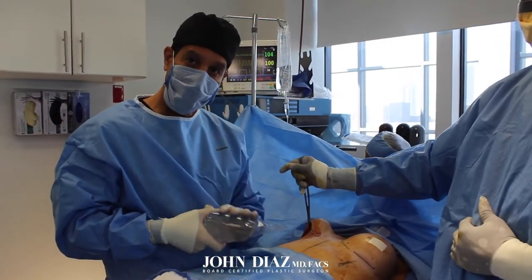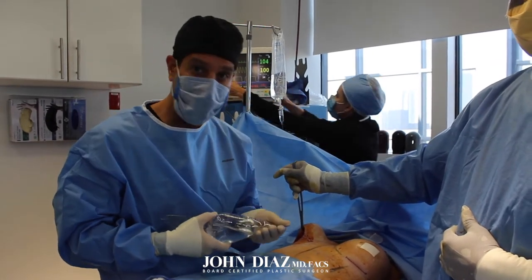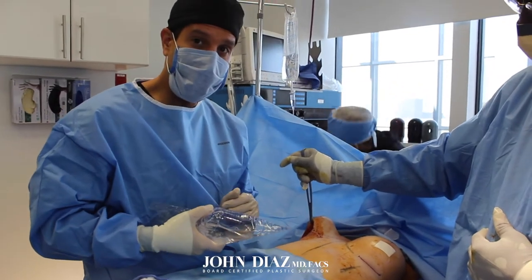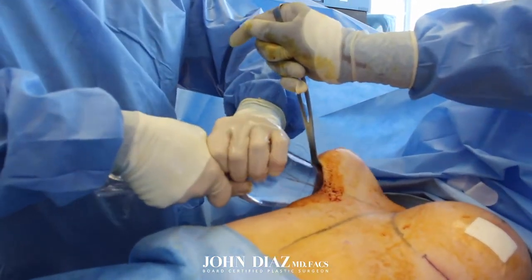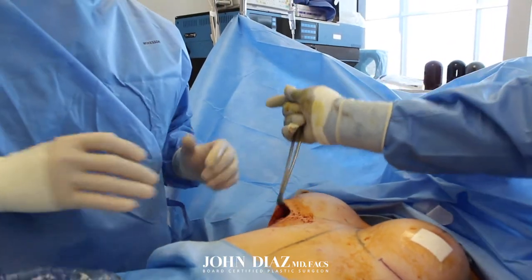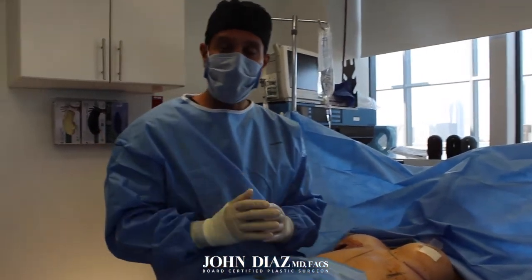The next step is to insert the actual implant. We're going to do a silicone implant measuring 385 cc's in volume, inserted using a no-touch technique. This is an implant funnel and it allows us to insert the implant with minimal effort and minimal contamination, to ensure that the breast implant goes in as safely and as cleanly as possible.